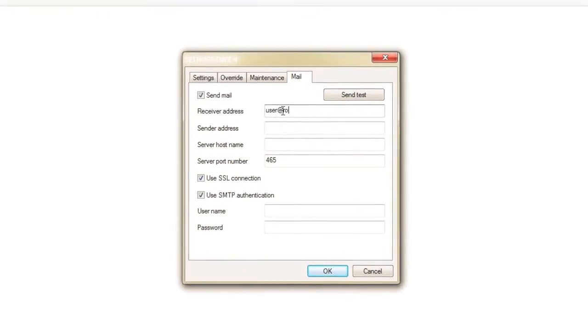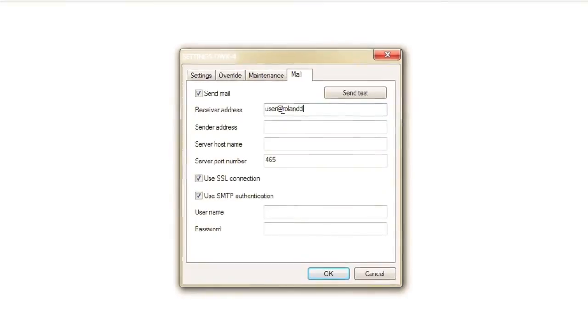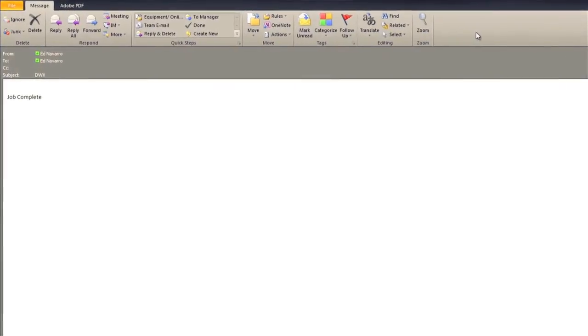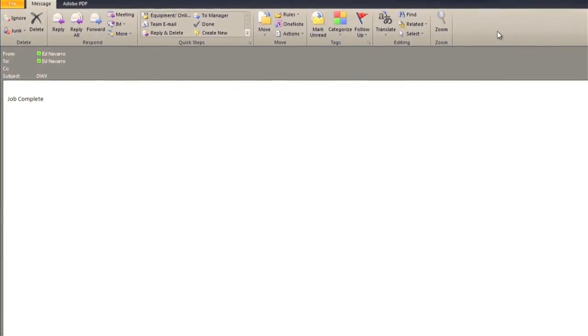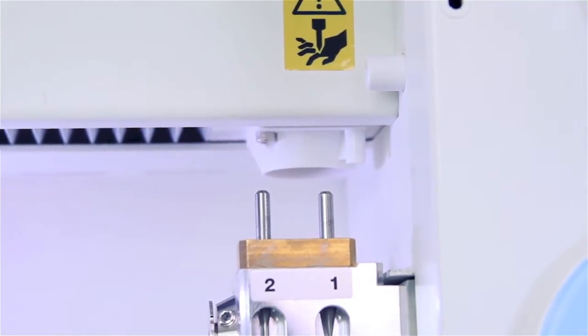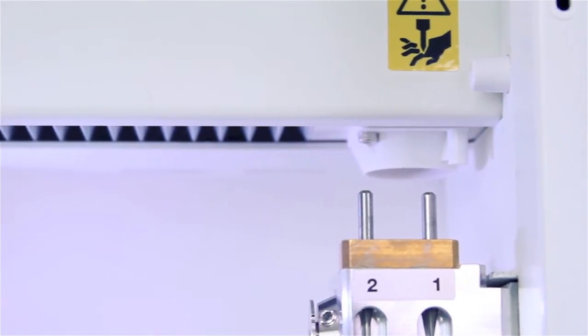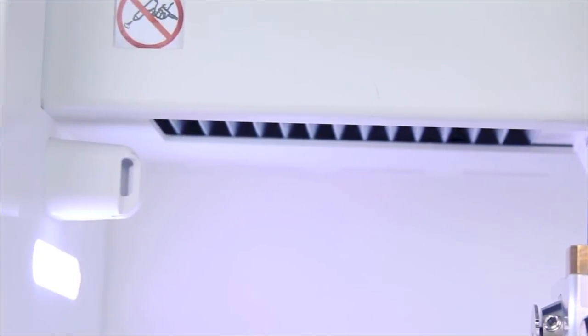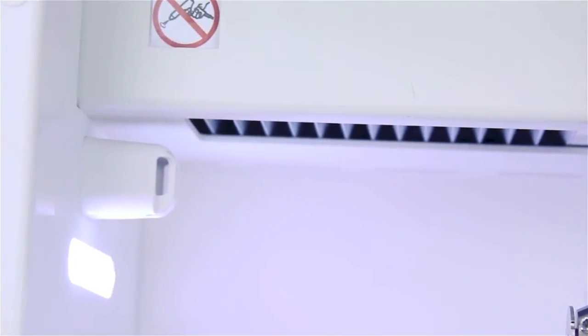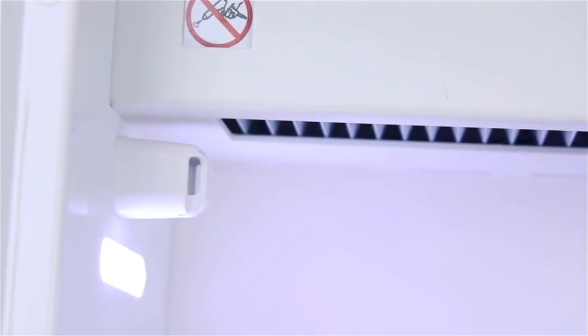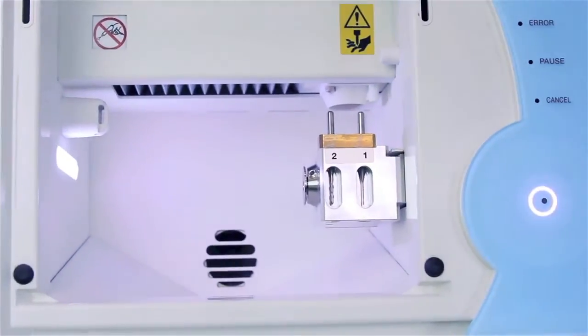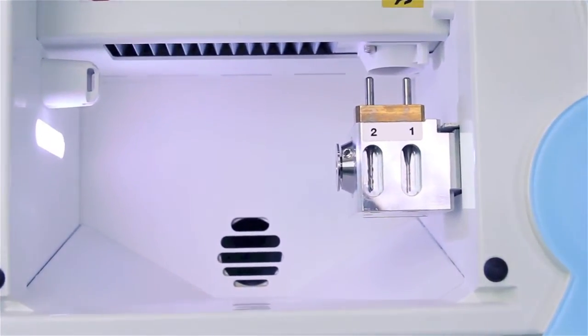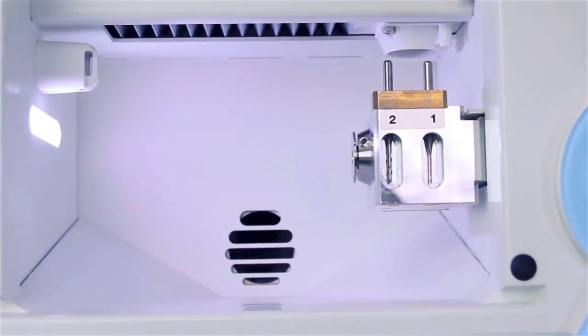The DWX4 sends email notifications of any errors or when a job is completed. The integrated air blower and negative ion generator prevent excessive dust buildup when milling PMMA. A dust collection sensor prevents the machine from starting if the vacuum is inadvertently left off.